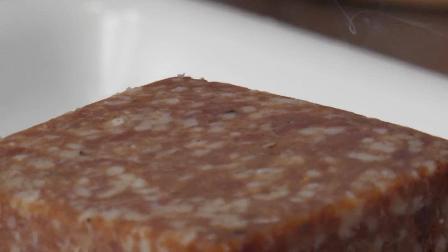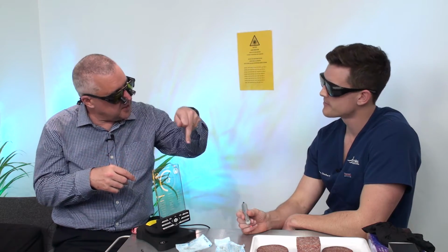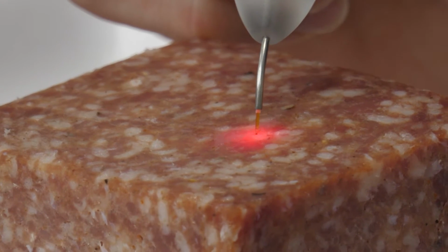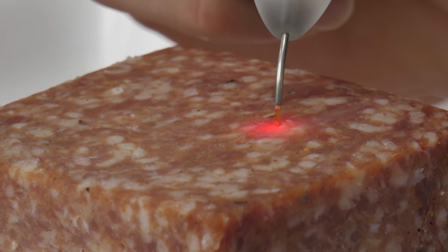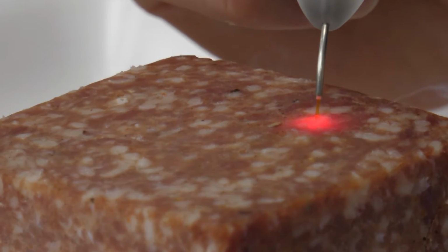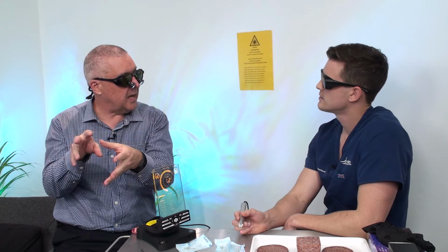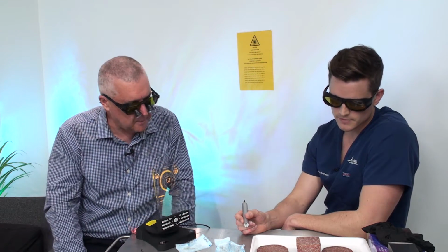And we can see the energy spreading into the tissue. Just run over that same area now, just to re-incise the same area for us. It's a great shame that you can't all smell this, because burnt salami is a wonderful thing. And there's actually a slight buzzing sound when the laser is running, because this laser is pulsing 50 times a second. So what's happening is every time there is a pulse, there's going to be a burst of cutting, followed by a little bit of cooling. And you probably noticed that sort of sizzling sound yourself.